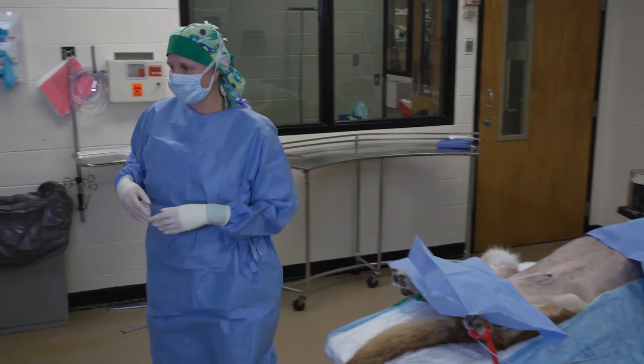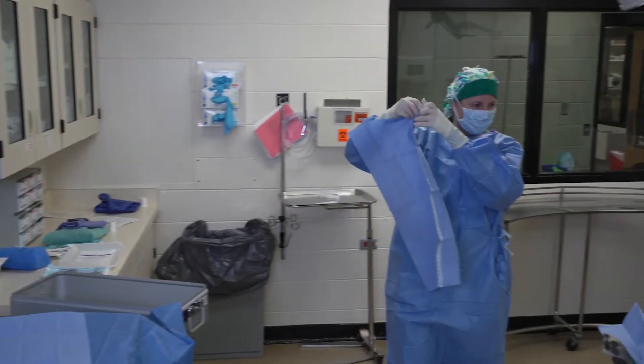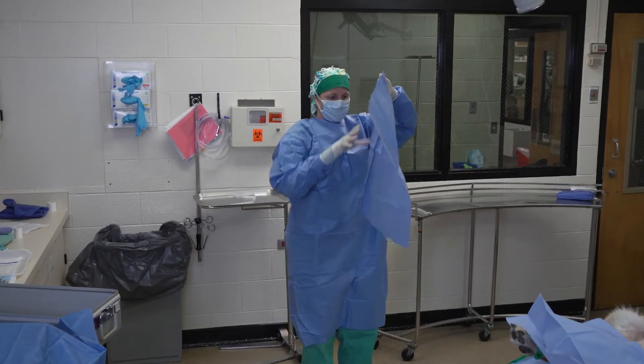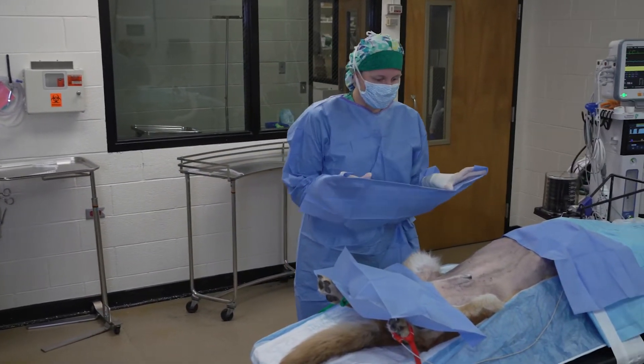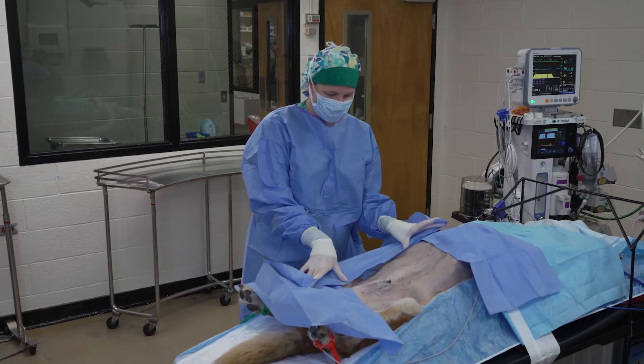My next drape I'm going to do on the caudal aspect — typically these stay a little bit better on the patient. Again, protecting myself and leaning away as I drape. Now I'm going to drape the side towards me, and that's going to give me a little protection when I have to lean across the table for the next drape. Again, wrapping the drape around my hands to protect.